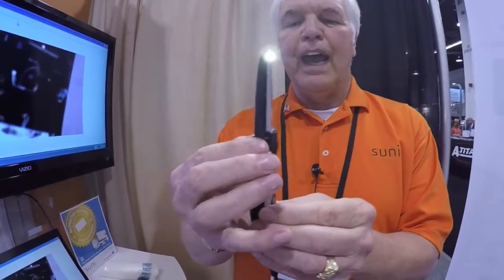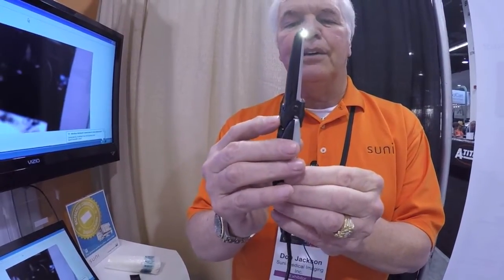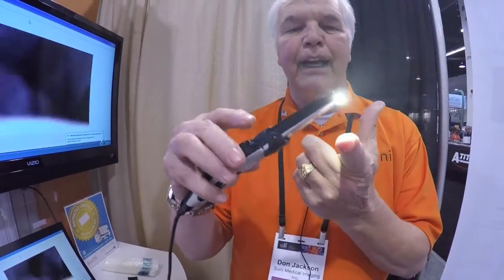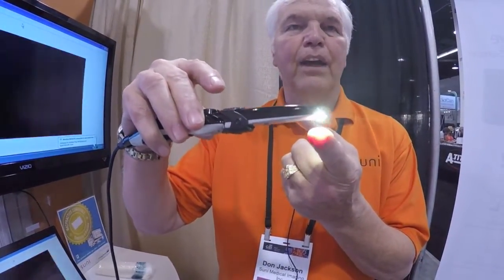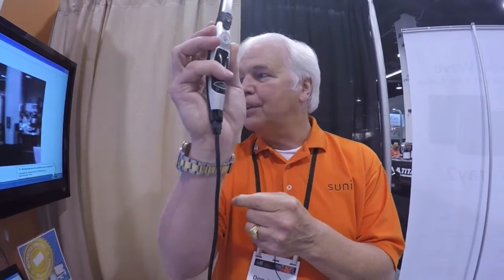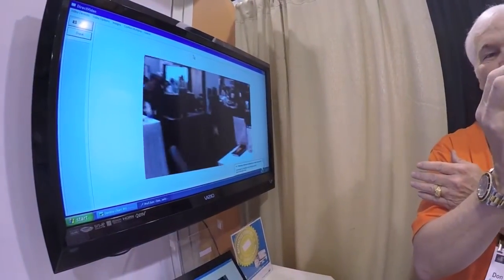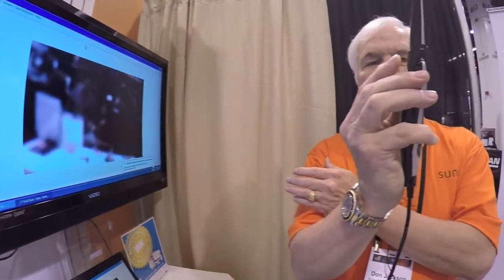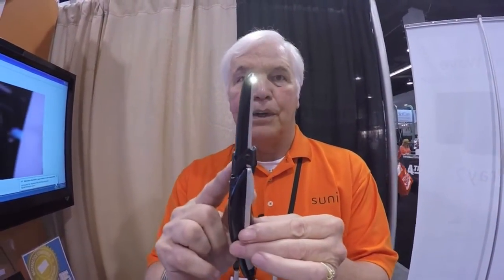We also have an adjustment here that you don't have to adjust. You can put it in one position, but that enables you to either get macro, where you can actually lay the edge of the camera down right on the tooth, or you can go to infinity, where you can capture the entire room or facility. But normally you keep it in the intraoral camera mode, where you're just going to do a quadrant or a couple teeth at a time. So you have your variable focus.